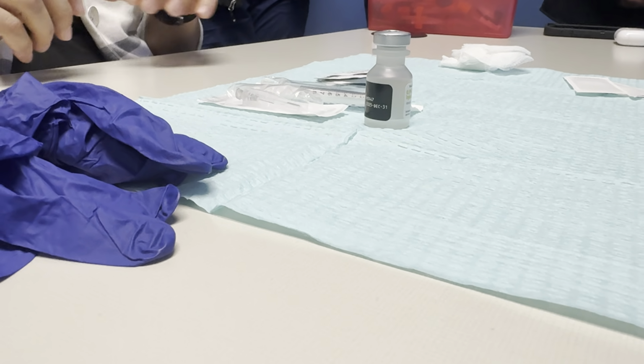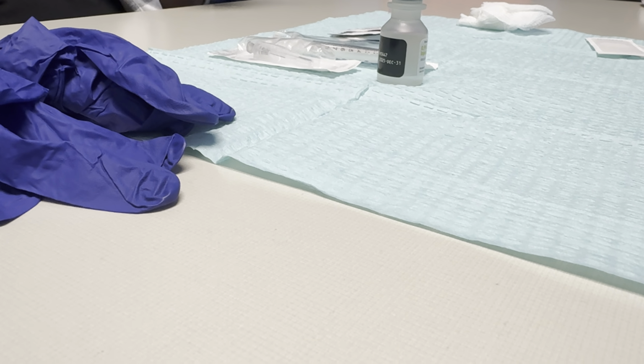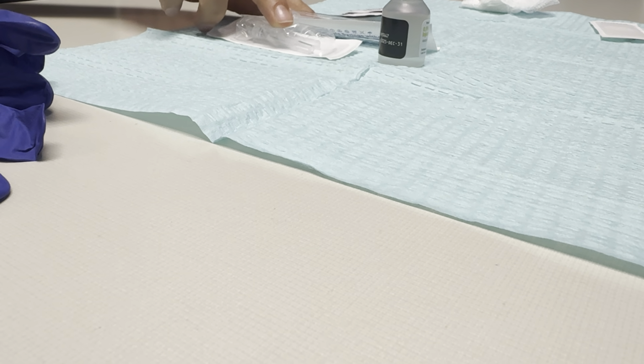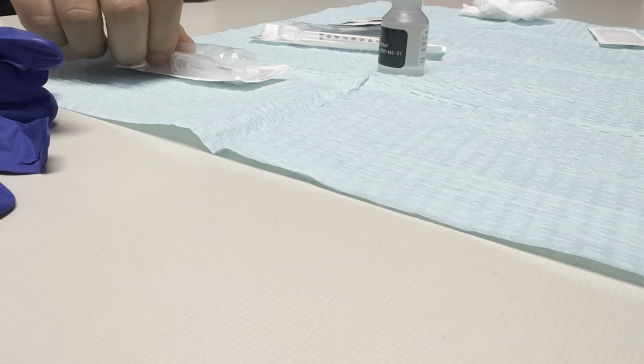Go ahead and set up your stuff. So right now, Mrs. Yushang said we're going to do one intradermal injection. So this is the supply I need. I'm going to grab my gloves. I need the needle to draw the medication. I know the right needle.